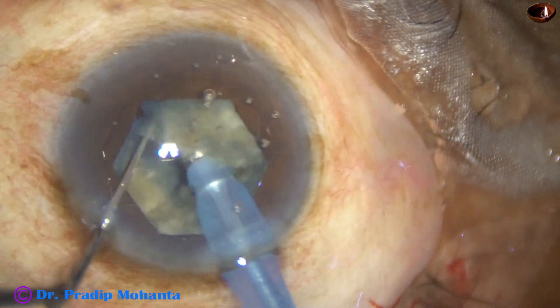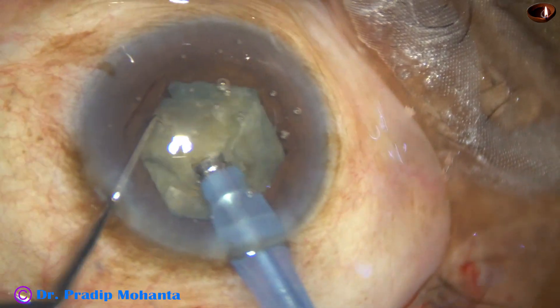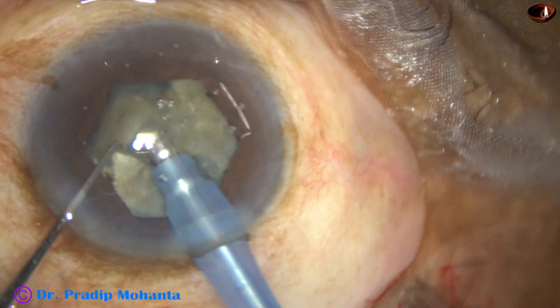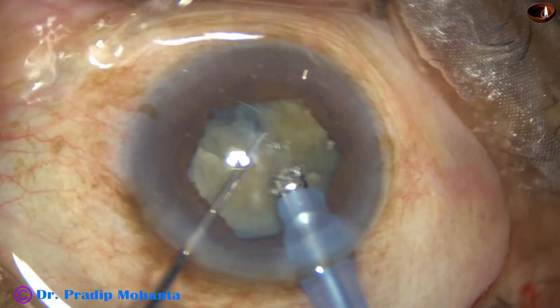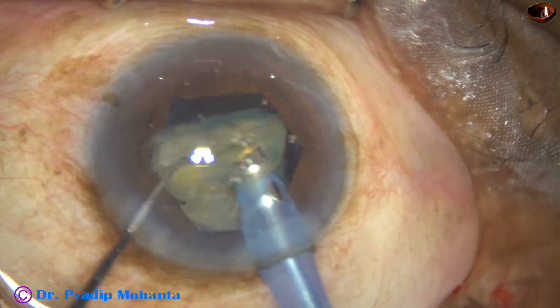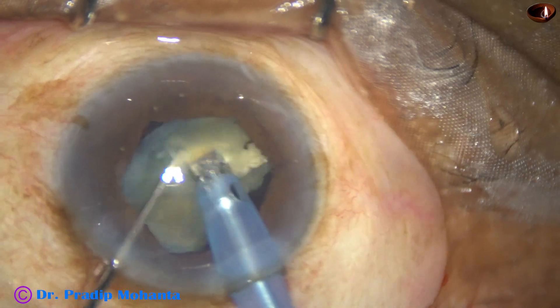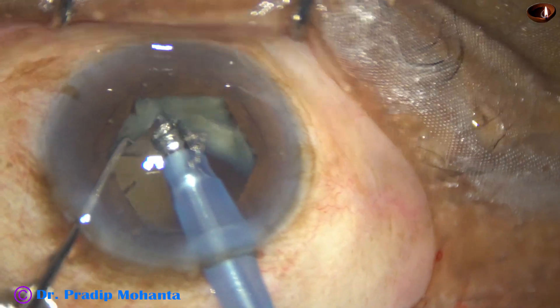No need to rotate 180 degrees. If the other end is not completely separated, we rotate 180 degrees and do some more separation of the hemi-nuclei. Each hemi-nucleus is subdivided into two quarter nuclei, and each quarter nucleus is again subdivided into smaller pieces. Ultrasonic energy is used from beginning till the last piece. Just before the last piece, vacuum is 400 to 450, flow rate 40 to 45 ml per minute. Ultrasonic energy, according to the hardness of the nucleus, was 80 percent in this case.